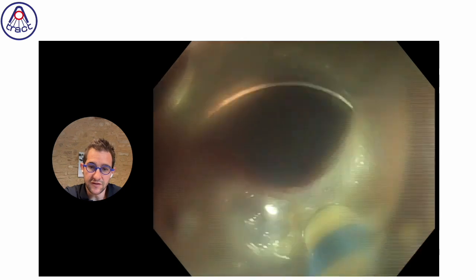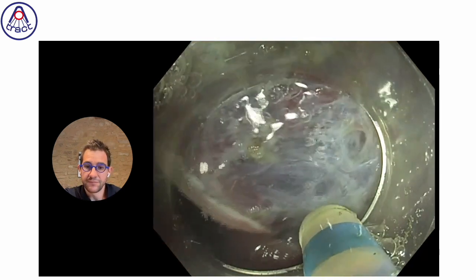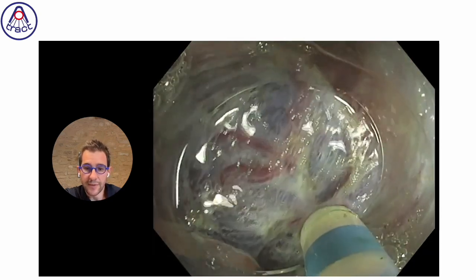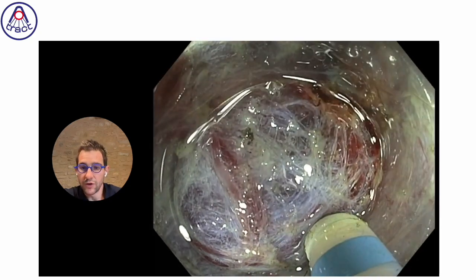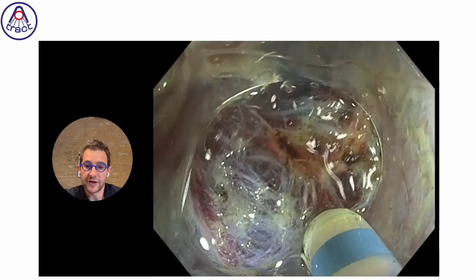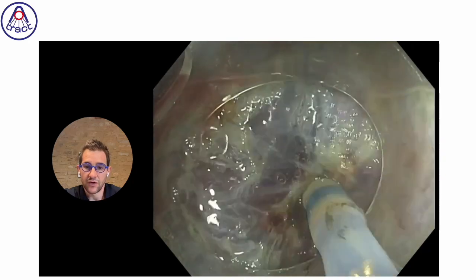So what I mean is that without traction, begin by the difficult side, the bad gravity side. With traction and with the capability to increase traction at the end, it's possible to work directly from the easy side to the difficult one, because traction will avoid a very bad exposure at the end.